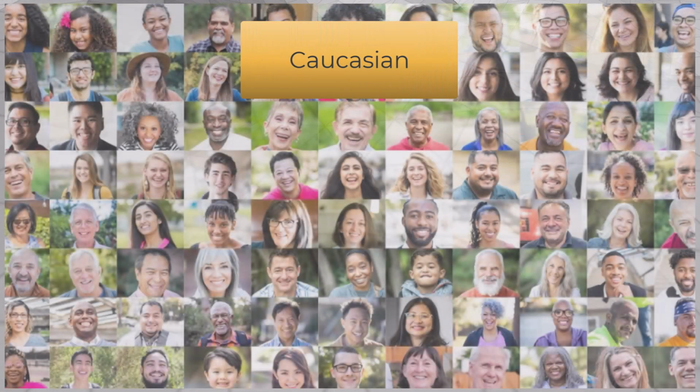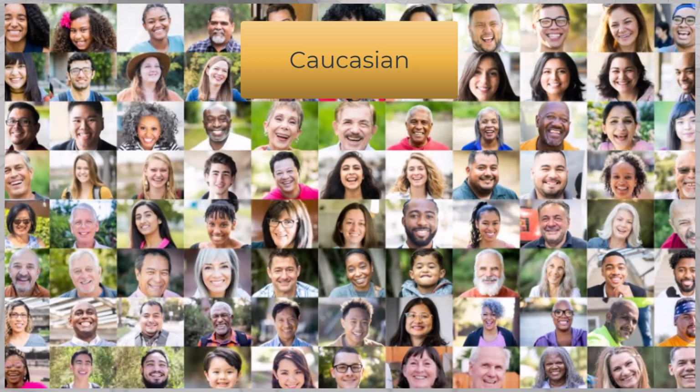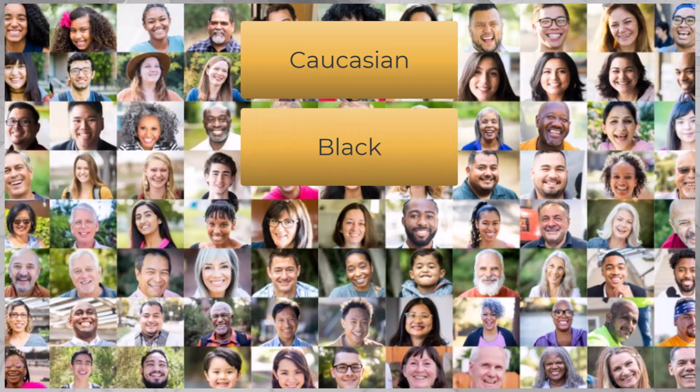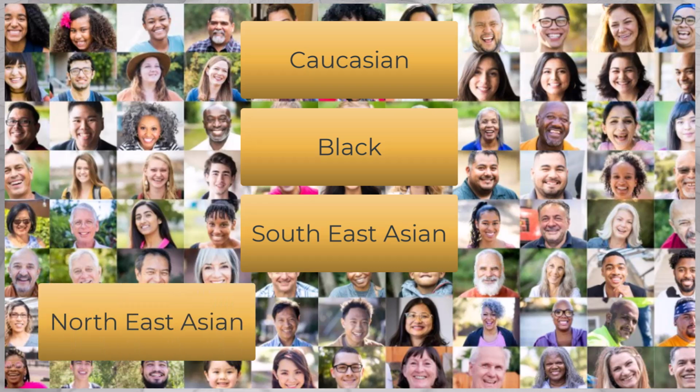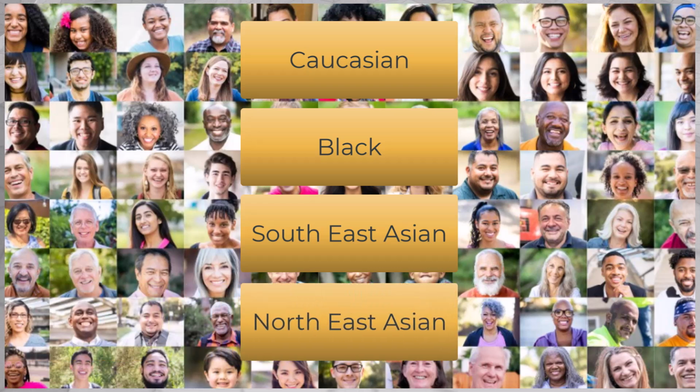It would be nearly impossible to question each patient as to their biological background and whether or not they fit into a specific race classification. With more and more of the world's population falling into the mixed race category, averaging the predicted values may be the best solution at this time to a complicated problem. It's only the next step in defining the important differences in what is considered normal and how to interpret results.